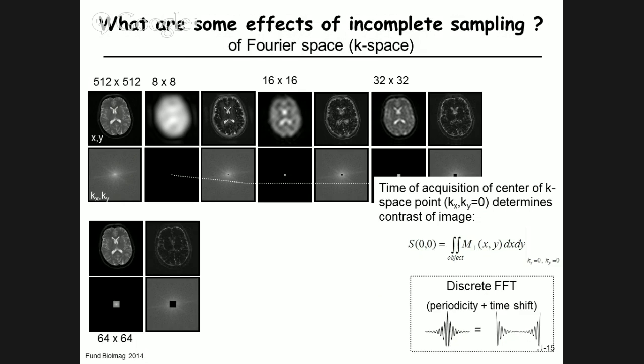What we have now, from the Fourier transformation, is that the time point at time 0 is proportional just to the magnetization. So that contains the contrast. What happens later here is encoding of position. If you look at the one-dimensional transform we had for spectroscopy, I talked about how the time point 0 is proportional to the magnetization, which means in Fourier space it's equal to the integral.